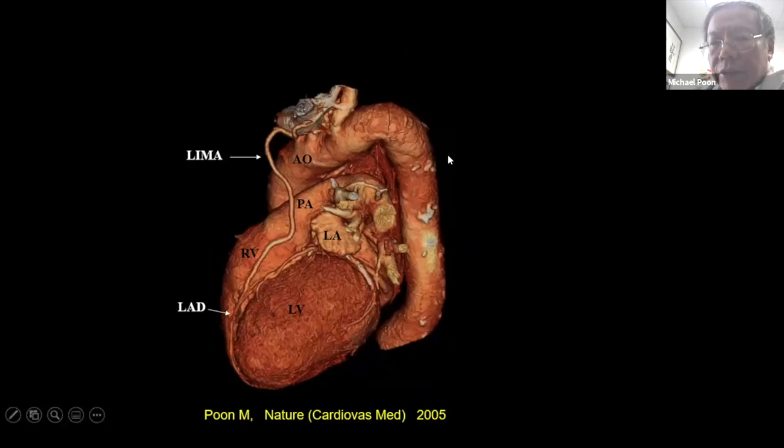So this is another patient who had a bypass, right? Basically, this patient had a blockage, something that I mentioned earlier, from high cholesterol, from diabetes, and from lack of exercise. You develop blockage in the native coronary, and this patient had a bypass surgery. So the surgeon went inside and took one of the blood vessels from the chest wall, the internal mammary artery, and grafted it and basically bypassed the blockage.